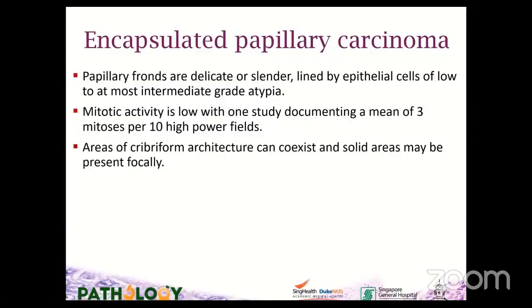Immunohistochemistry for the myoepithelial markers P63 and cytokeratin 5/6 discloses that there is a complete absence of myoepithelial cells within the fibrous septa as well as along the outer wall of the neoplasm.